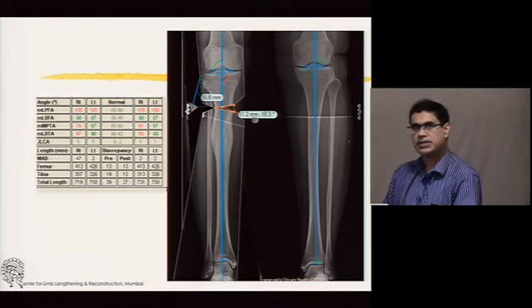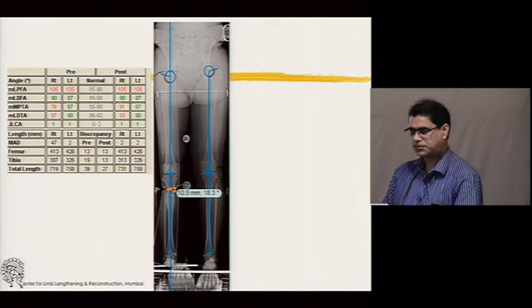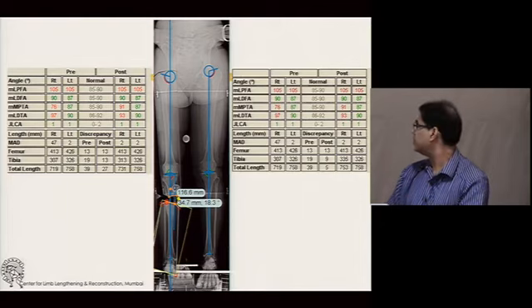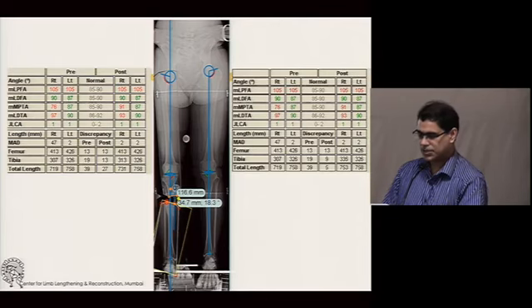So therefore, a fixator makes more sense, where we can do a gradual correction of the deformity as well as lengthening. So if you add length, the numbers now are equal. The chart on the right side shows you with the length achieved, and the chart on the left shows you without any length correction.